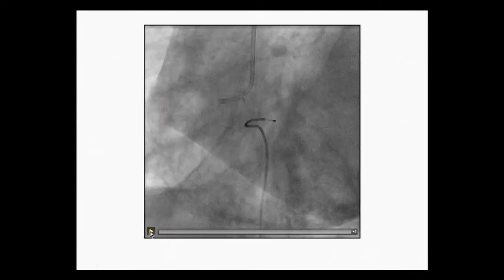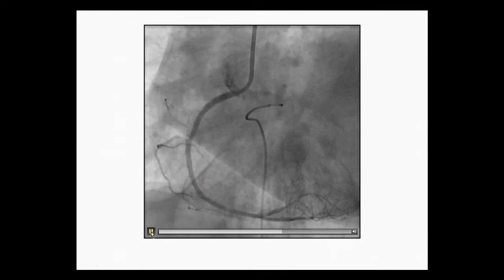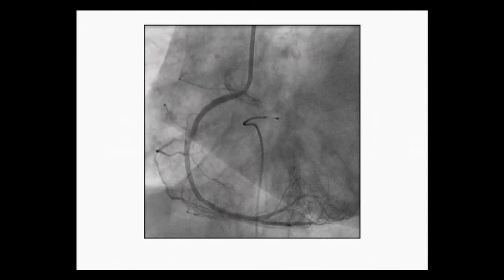And this is post PTCA of the RCA. Beautiful. Nice. In the old days, we'd be very happy with this. I'd love to see the ventricular function in a couple of weeks to see how much recovery.